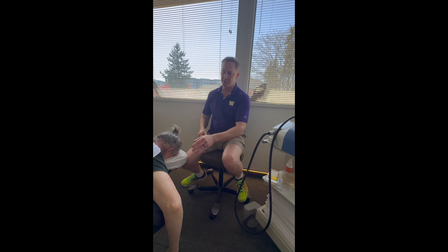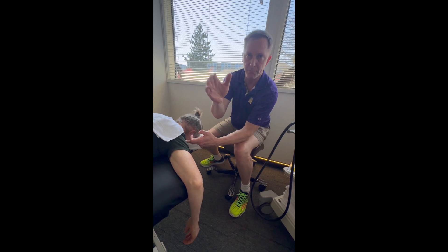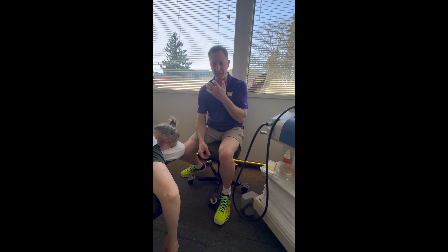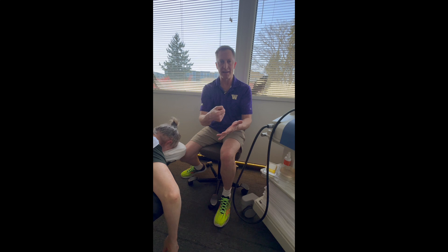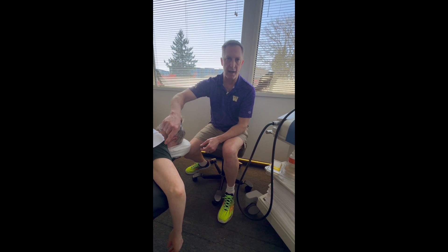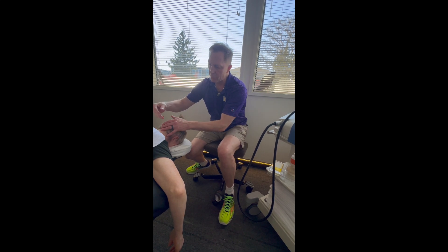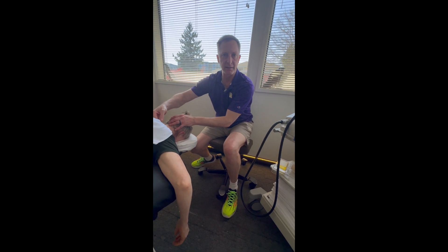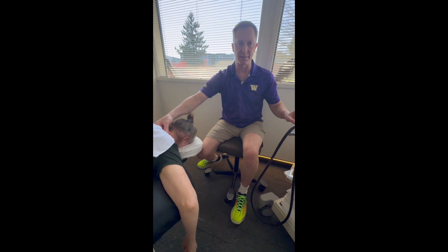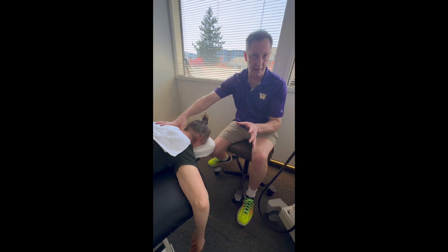The sound wave will go clear down to the bone, into that interface, and then come back out. It can travel along — for example, going into the shoulder between a couple of bones, aimed in there, the sound waves bounce off the bones and go deep in. The reason we're using this glorified massage gun is because it doesn't get tired, there's no mechanical action, and it can fire those sound waves continuously. Unlike normal therapeutic ultrasound where you have to keep moving, we only move it once we find one of those inflammatory areas — identified by a deep achiness.